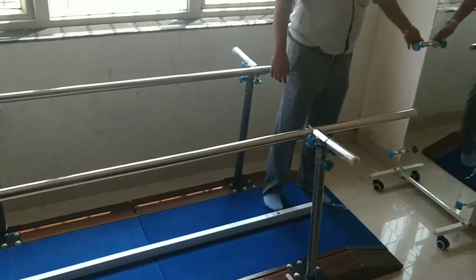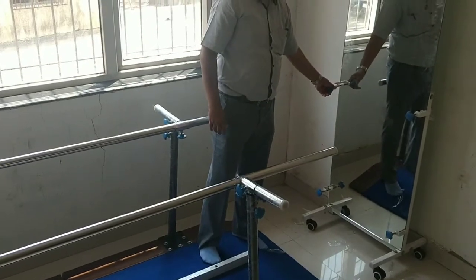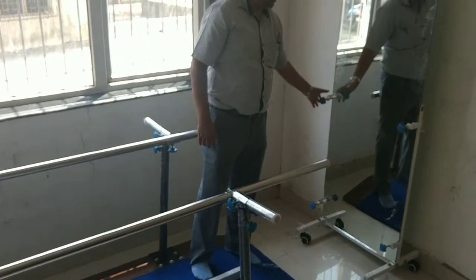This is one of the parallel mirrors for this parallel bar. This comes separate.